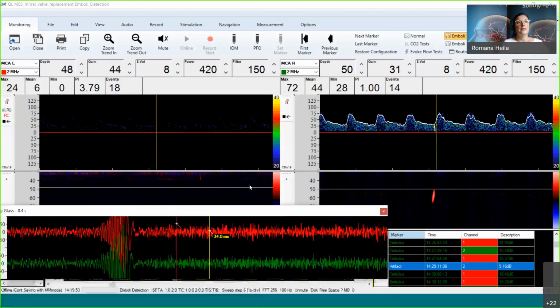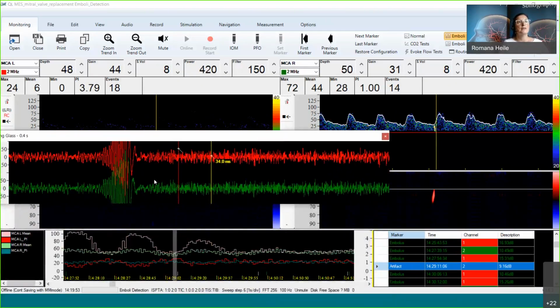And if we have a look, then we can see this is the embolus. And this is something within here, a variation. For any reason, maybe it was this one, this looks like a spindular waveform, but you can see it's not identical with the green signal. So this is looking at this little dot, so correctly identified as an artifact. Let's see what else we have.